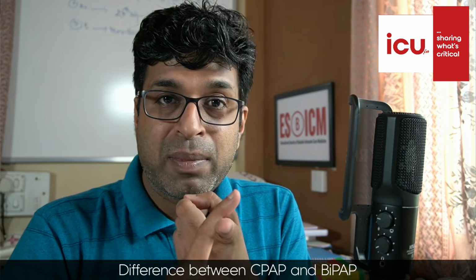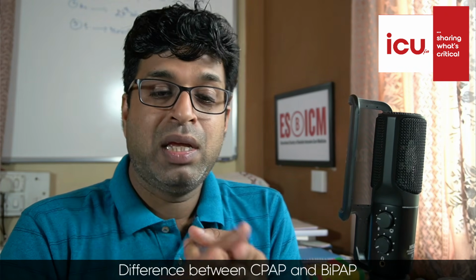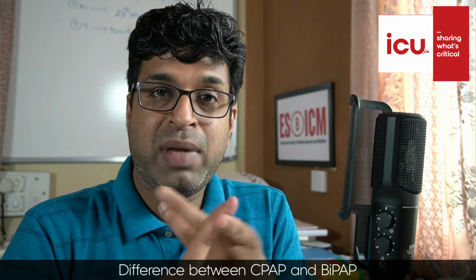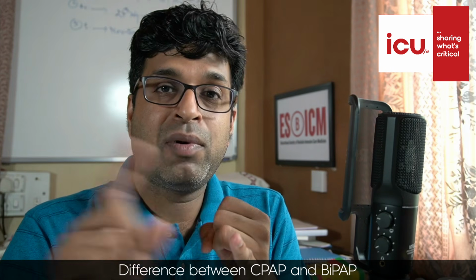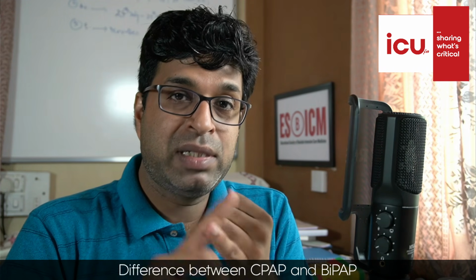Your CPAP is equal to EPAP on BiPAP, which helps increase the oxygenation, and it is also the PEEP on a ventilator mode. So your PEEP, CPAP, and EPAP are the same, and they help to increase the oxygenation. Your IPAP is pressure support above PEEP on NIV mode on a ventilator, and on BiPAP it is IPAP.